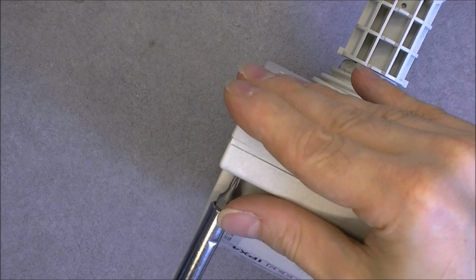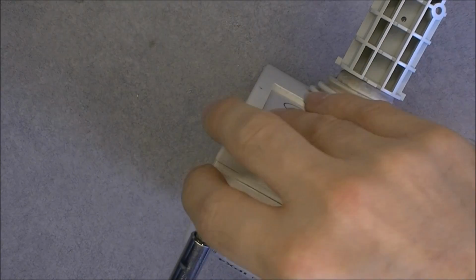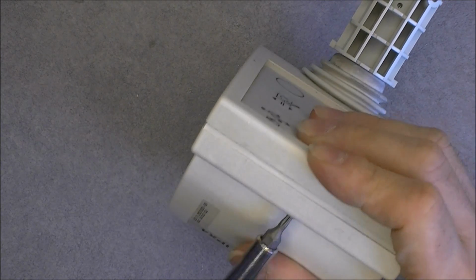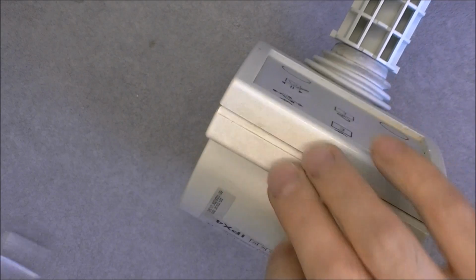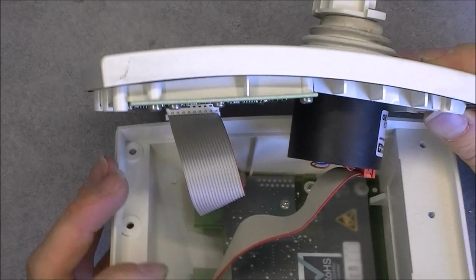So it is quite a lot of work to take this thing apart. It is obviously not made to be field serviced. You replace it and you put it to the workshop to repair it. Okay, so we have some kind of a rubber seal in the cover, and here we are.